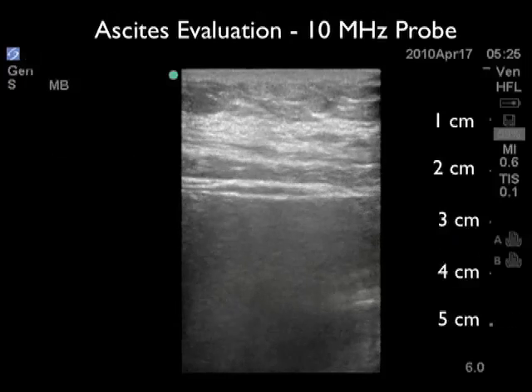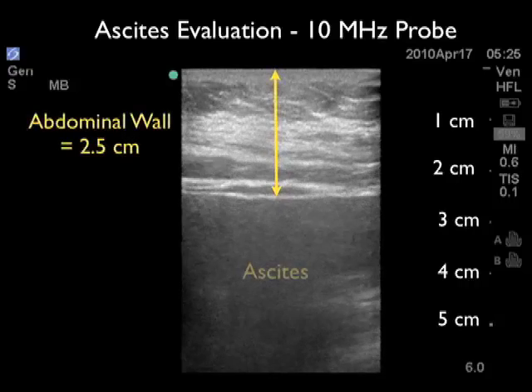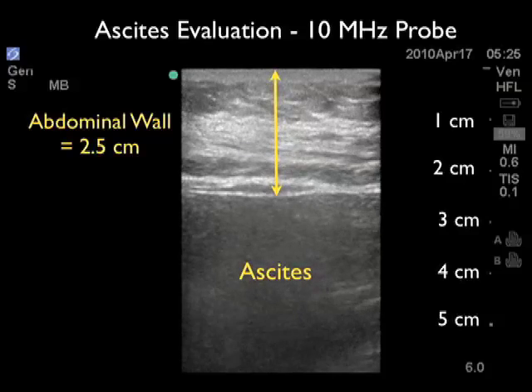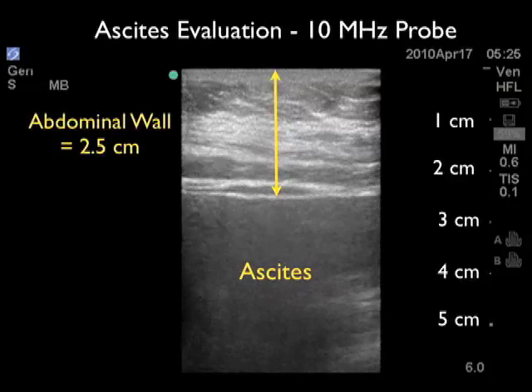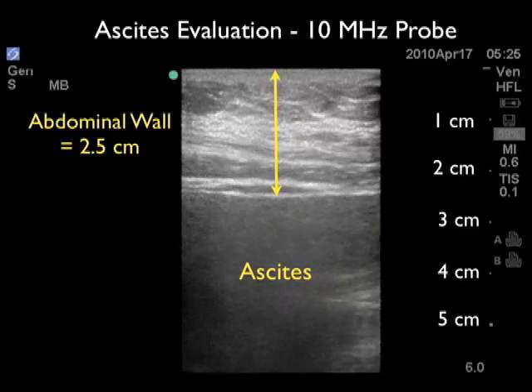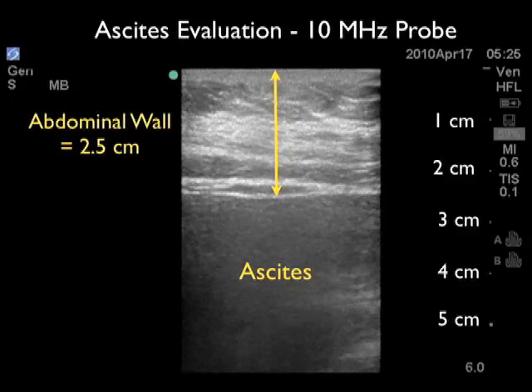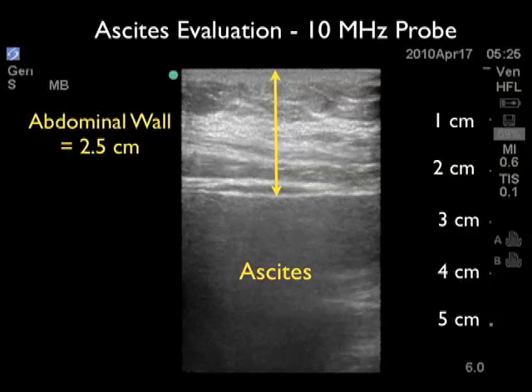In this video clip we've moved the probe slightly lateral from the last position in the same patient. Again, we note the deep abdominal wall at 2.5 centimeters, indicating a longer needle will be needed to reach the ascites. Here we see a large collection of ascites and note the absence of gut sliding, denoting a larger pocket and a more favorable position for the paracentesis procedure. This is actually the position in which we perform the paracentesis using a longer lumbar puncture needle, and we're safely able to get the ascites fluid out for lab evaluation.